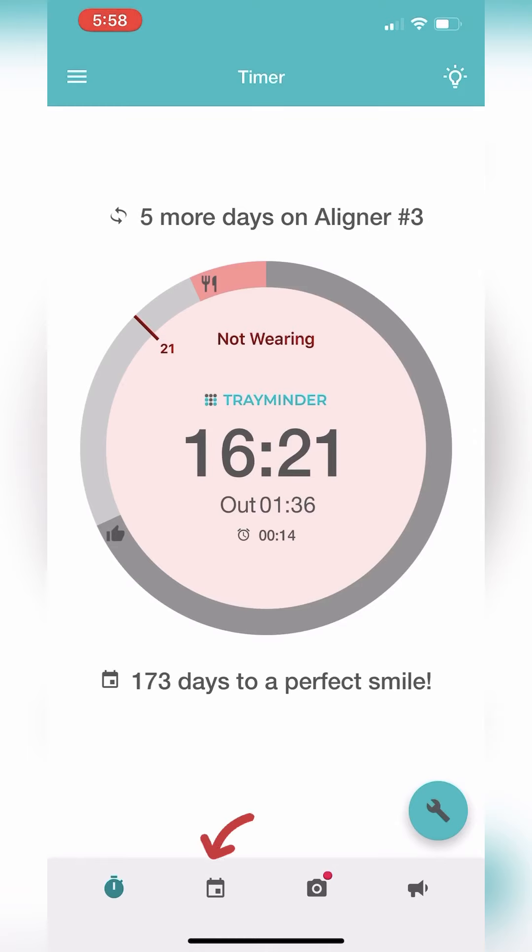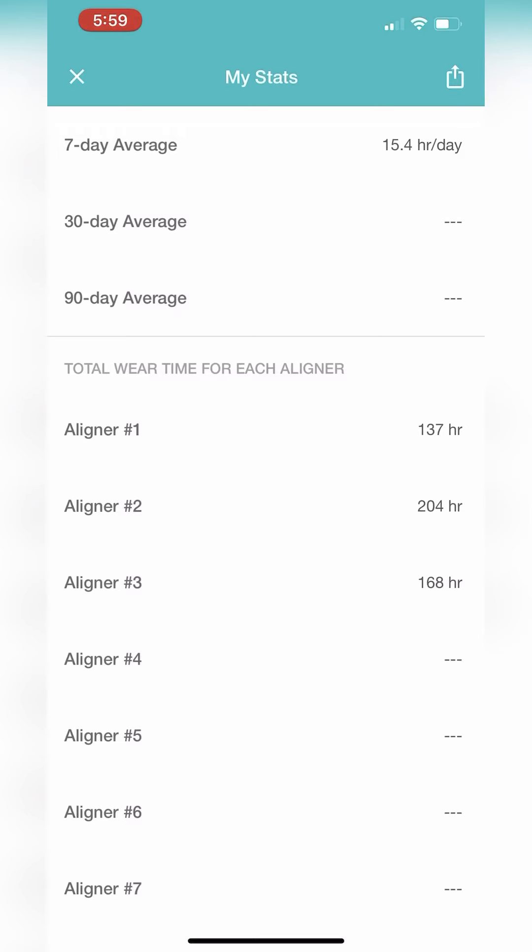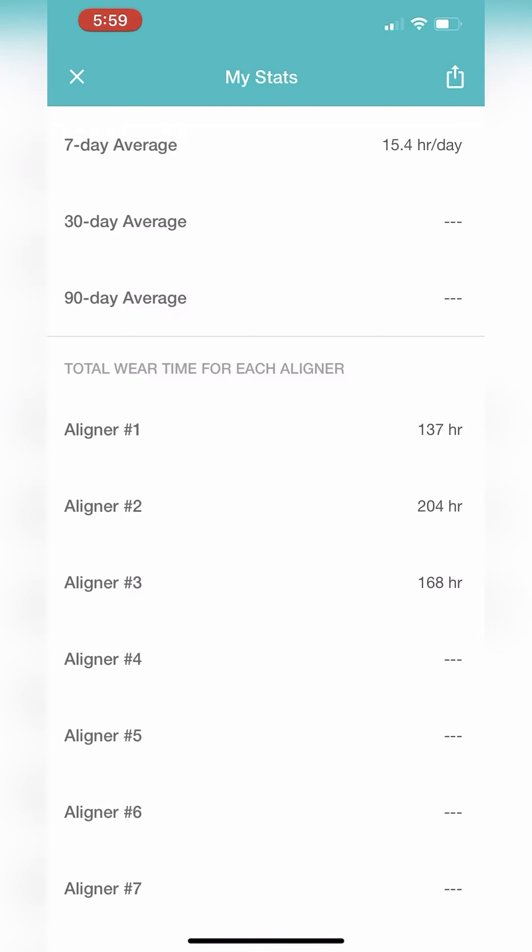The next tab is the calendar. The calendar gives you a big picture view of how well you've been meeting your daily wear goals. If you want to see your wear time statistics, tap the three horizontal lines on the upper left-hand corner and select view my stats. Here you can see your 7, 30, and 90-day averages as well as the total wear time for each aligner.